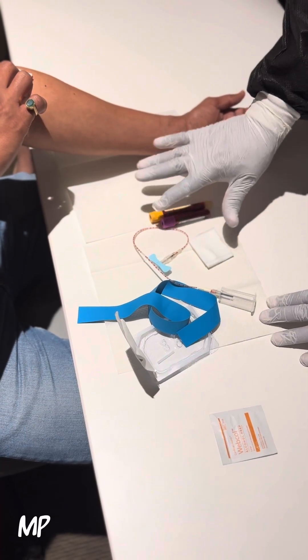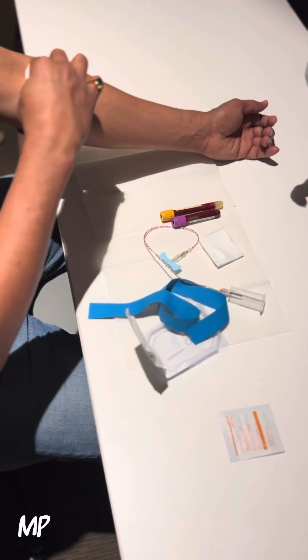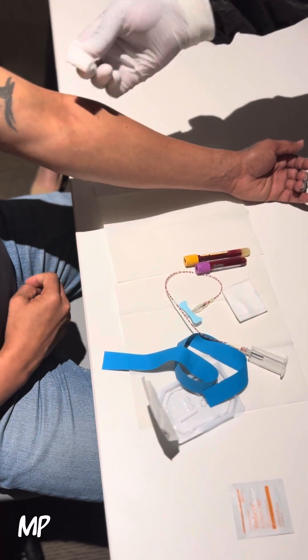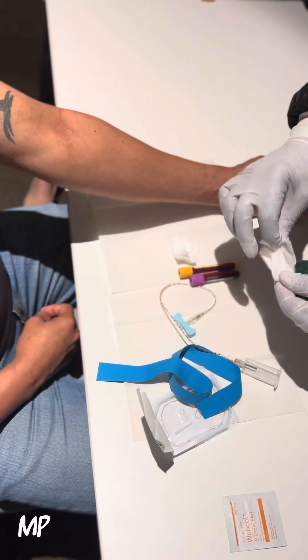Cross your tubes labeled, sent to the lab. I'm going to take a look at the site, make sure everything is good. We can replace that bandage with a brand new one.